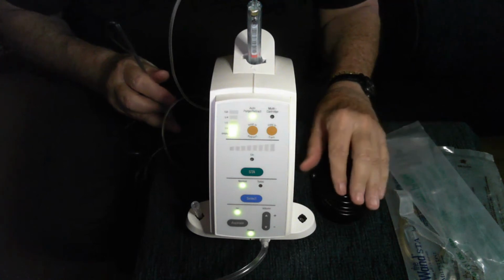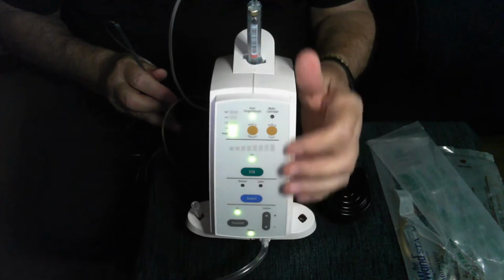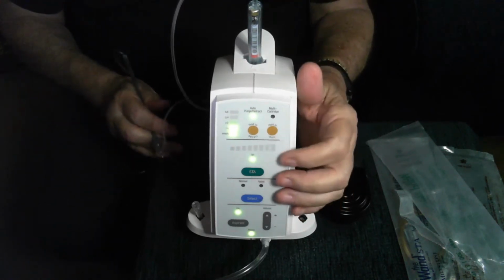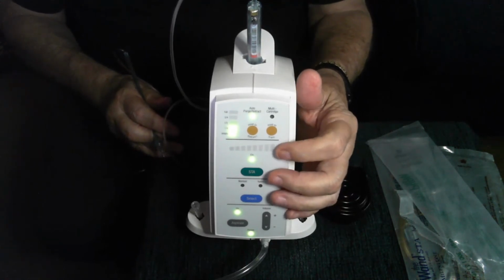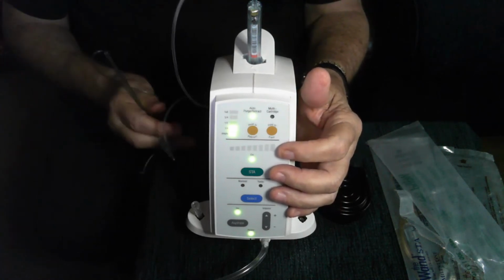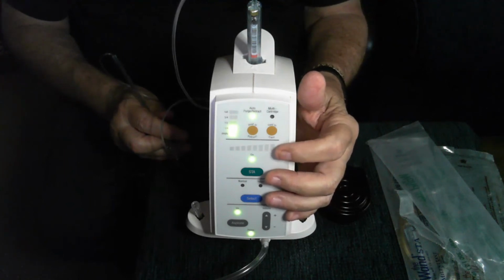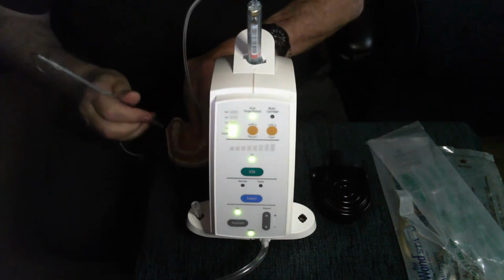Okay. Now, there's some other features to this I want to talk to you about. If we're on the STA mode and going at that control flow rate, when we're doing an intraligamentary or a single tooth injection, as we call it, these lights are what we call DPS lights, and they will come on to tell us that we're in the proper spot to give the injection, typically the bottom of the sulcus or the top of the periodontal ligament space. So I'm going to try and demonstrate what this would sound like on a Typodont.